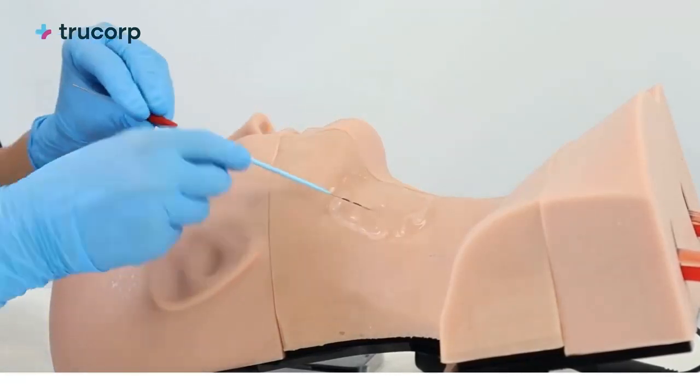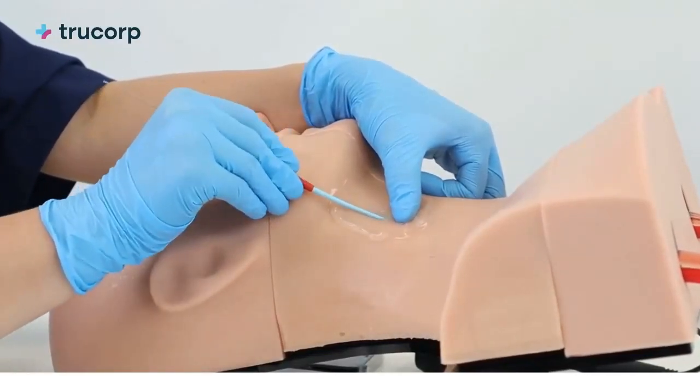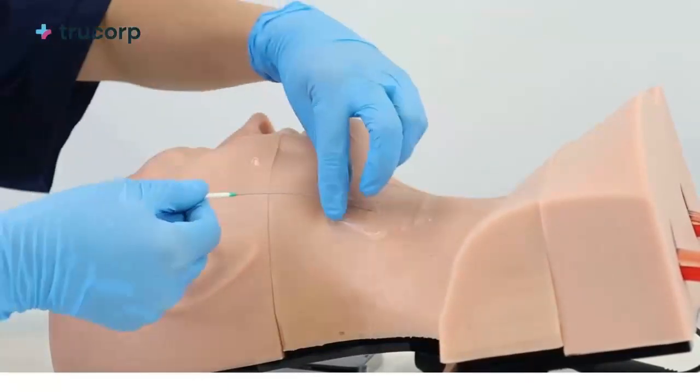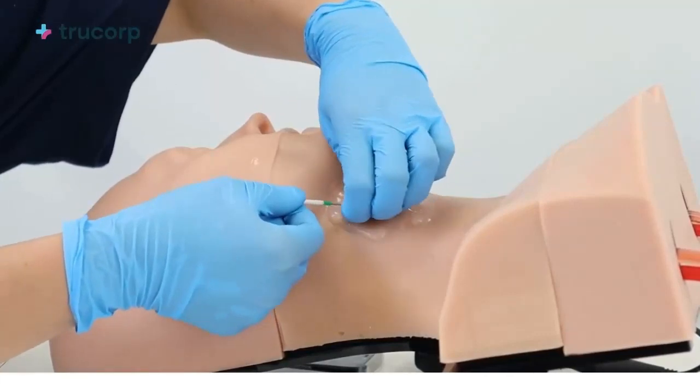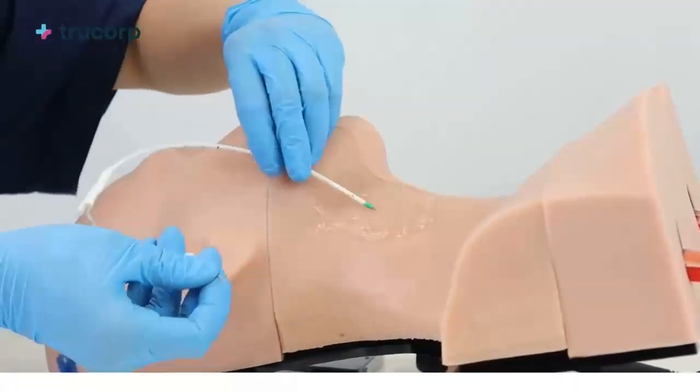Each TruCVC insert facilitates over 20 full catheter insertions and 1,000-plus needle insertions. The TruCVC does not have a limited shelf life, therefore this unit can be used over an extended period of time without vast deterioration to the insert.